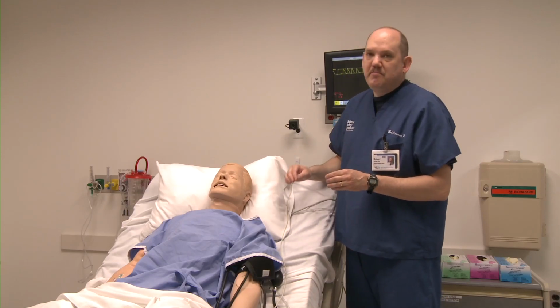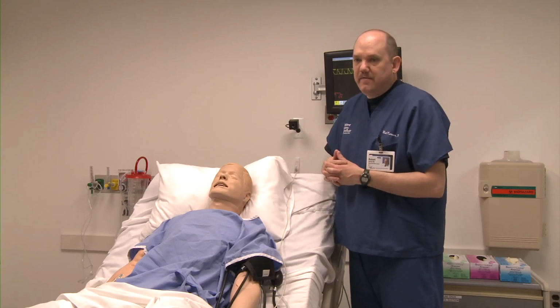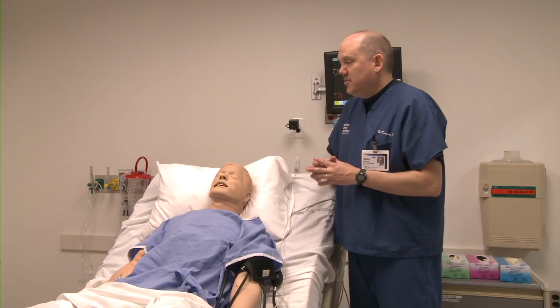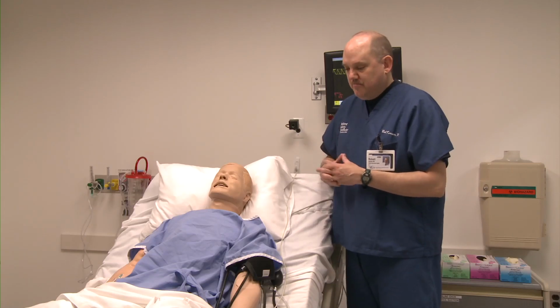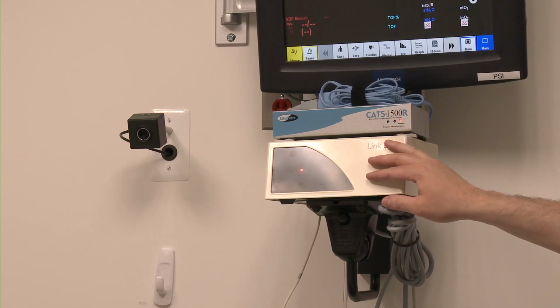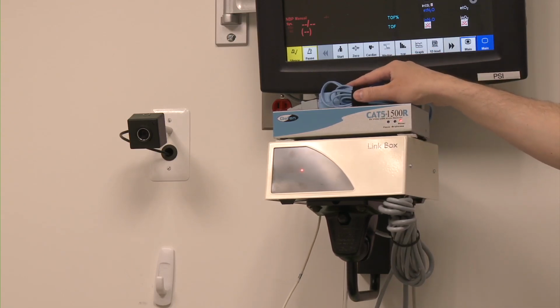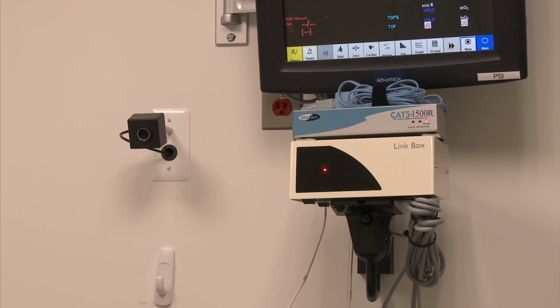So if your patient is having respiratory difficulty, you might expect that the pulse oximetry reading will be affected by that difficulty. Similarly, if you give your patient oxygen, you might expect that the pulse oximeter would reflect that and show improvement. You will see some other technology hanging off the head wall close to where the pulse oximeter cable hangs. These boxes hanging on the wall control the mannequin. We'd ask you please not to touch the box, and please don't be tempted to pull the cable off the top of the box. This is not the pulse oximeter cable. The oximeter cable is hanging to the left side of that on the little clip.